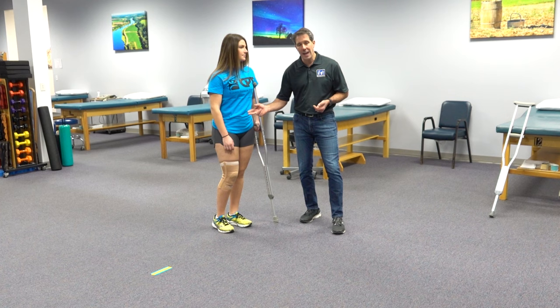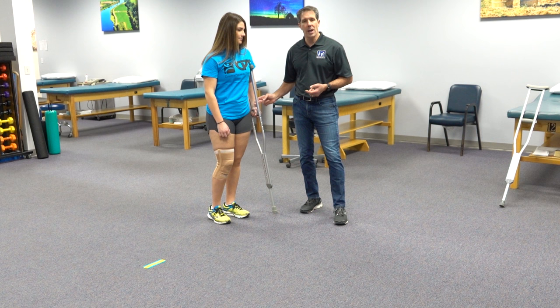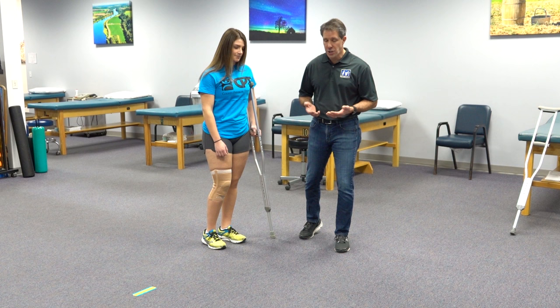That's very important. The reason that's important is that you're actually able to take better weight off of that leg while distributing the pressure through this arm, and it also helps to normalize how you walk to prepare you for walking without a crutch.